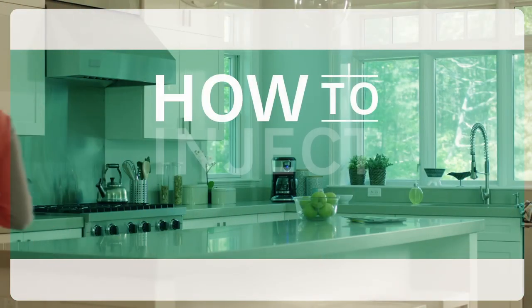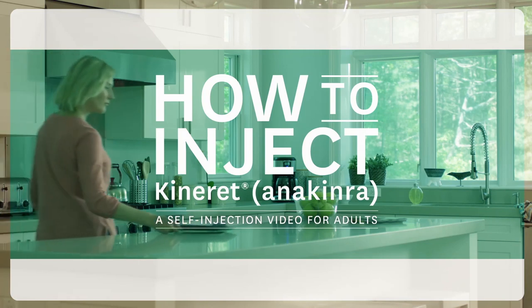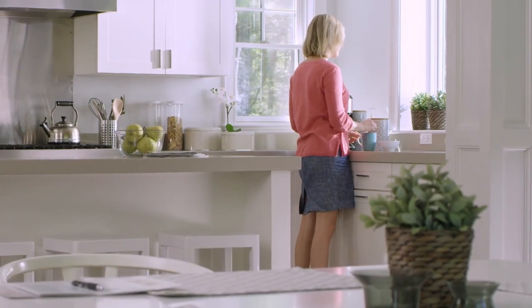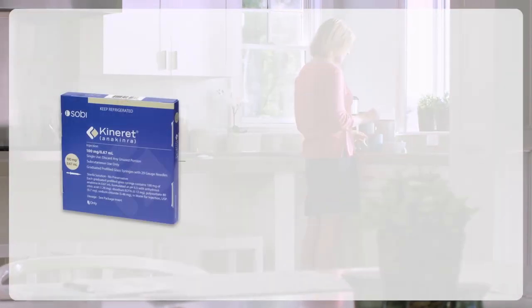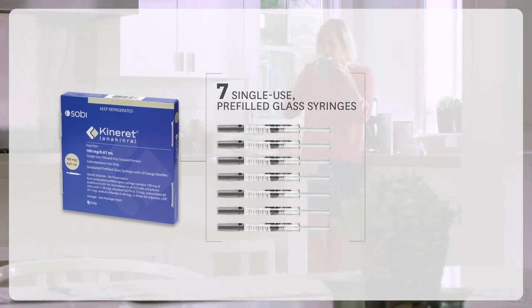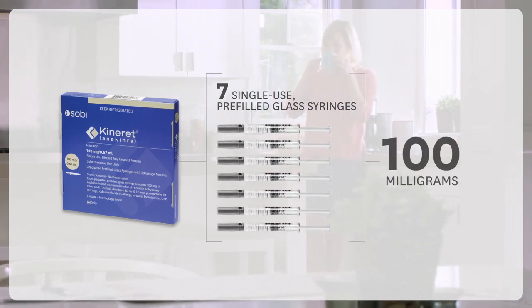Hello and welcome. In this video, I'll show you how to inject Kinneret, or Anakinra. Kinneret is a daily injection that my doctor has prescribed to treat my rheumatoid arthritis. Kinneret is shipped straight to my house in boxes of seven single-use, pre-filled, graduated glass syringes, each containing 100 milligrams of Kinneret.